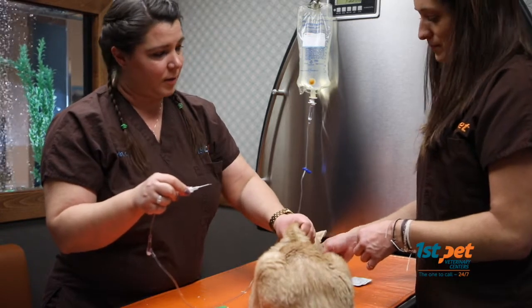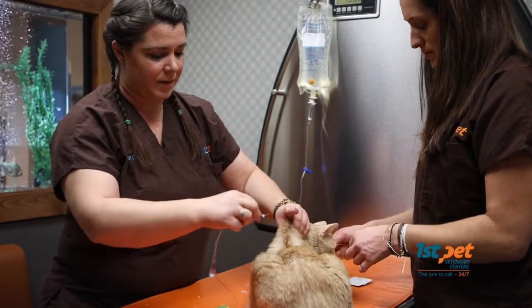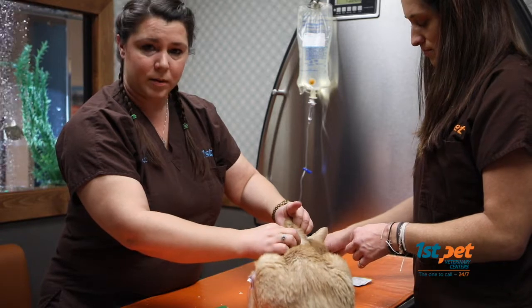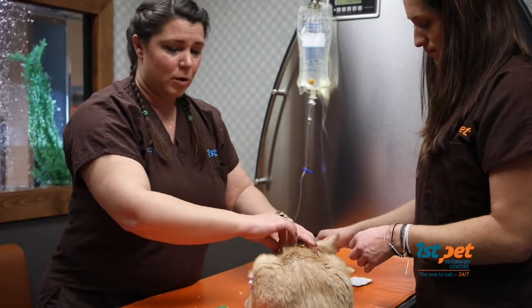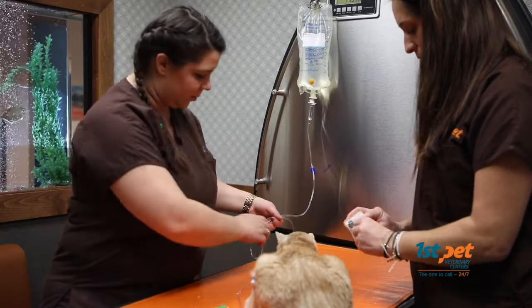I'm going to go ahead and grab my area, make my teepee, and I'm going to take my needle and give a good quick poke. You want to make sure that you're poking straight in and not upwards, because you might poke yourself, or down, because then you could accidentally hit the muscle of your pet.